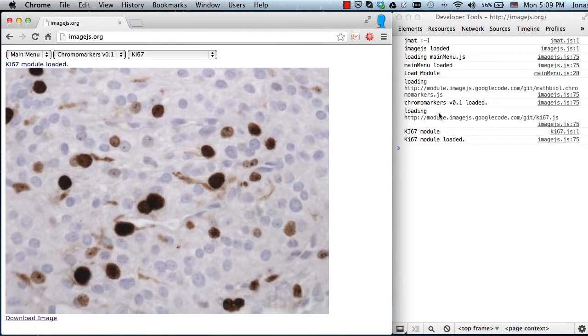No, they'll load it. So what has happened today is that at some point I was able to get a 500 error, which is an internal server error on the Google side of things. And this is the way you can find out if there is some problem going on there or not. Now back to the KI67 analysis.